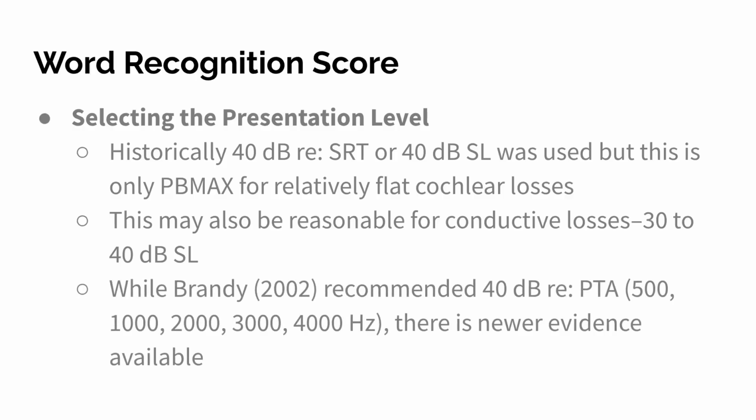While Brandy 2002 from their textbook recommends using 40 dB above the pure tone average, using a slightly different pure tone average of 500, 1000, 2000, 3000, 4000, there is newer evidence available that is probably more evidence-based than Brandy's recommendation.